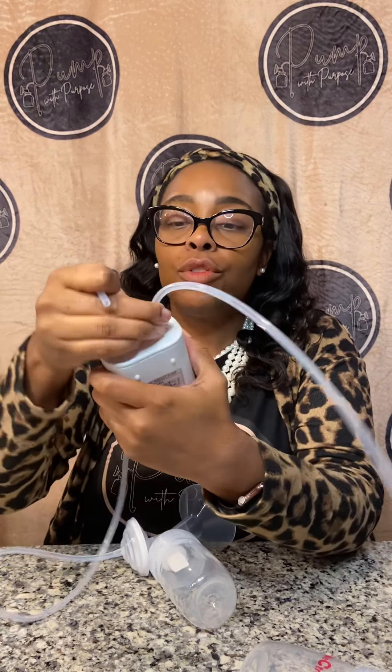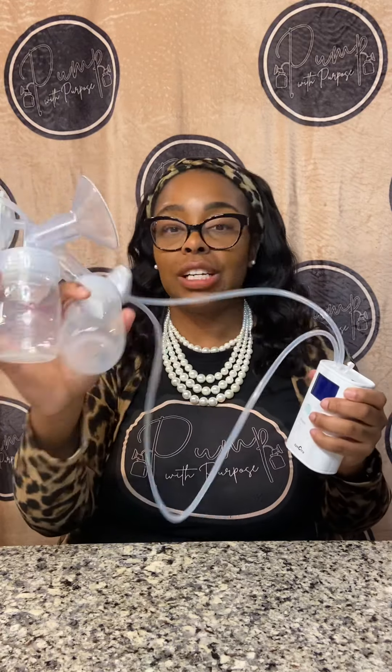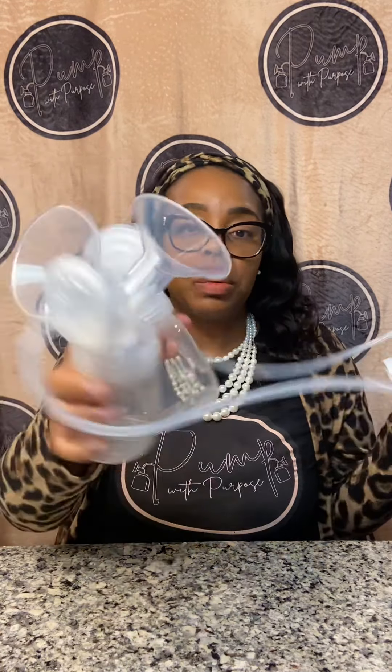The tubing goes in the top. If you want a single pump, you close this up — so it has that option, which is a positive. Then you put both tubing pieces in and it is good to go. It's just like the other Spectra pumps — no different with the tubing and everything. All the same parts, which is also a positive.